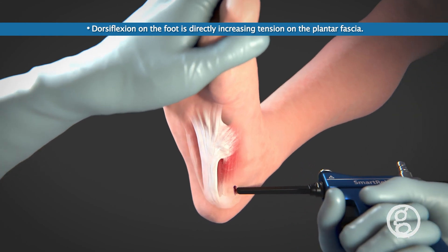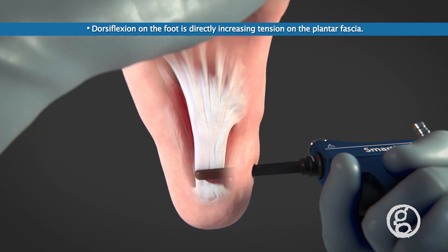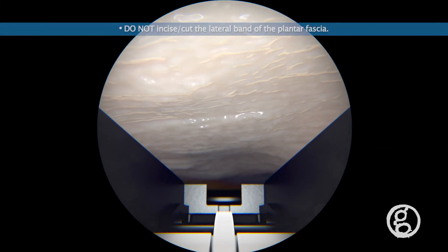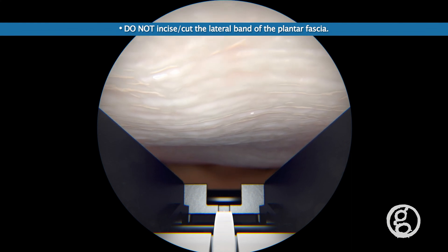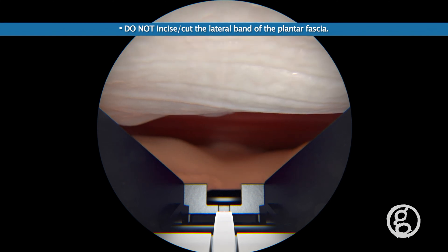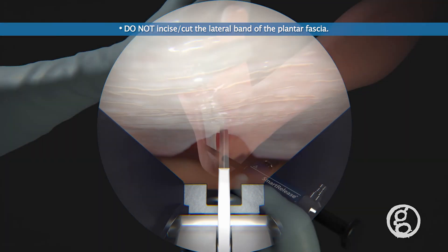Once the blade assembly is ready to be inserted, the foot is dorsiflexed upon insertion. Attention is directed to the endoscopic view as the device is introduced into the foot. In the endoscopic view, the medial and central bands of the fascia are visualized along the surgical path, and a clear view of the fascia is confirmed.